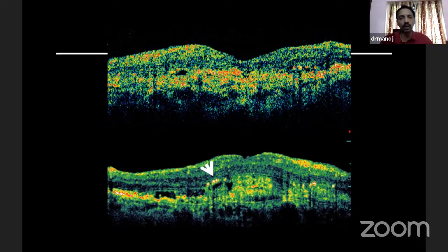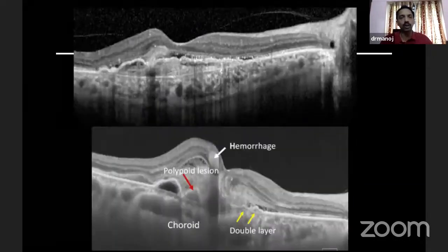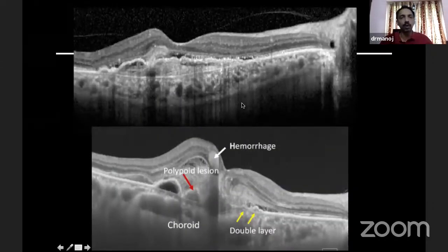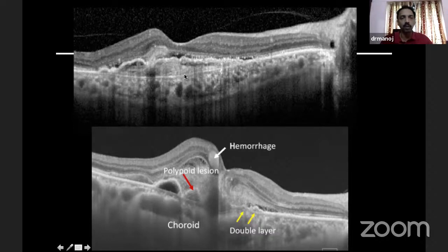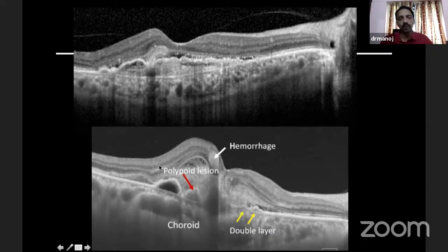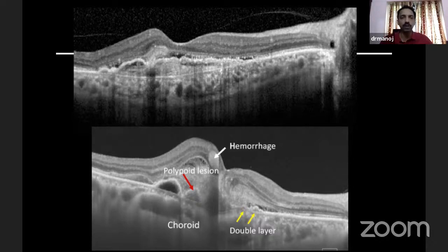You don't see the individual layers very clearly. In contrast, these are spectral-domain OCT images where you can see all the individual layers very clearly — especially the photoreceptor layer and the retinal pigment epithelium layer. This is an example of a swept-source OCT, where in addition, you see the choroid very clearly. Looking at the scan, you need to first identify what type of scan you are dealing with.